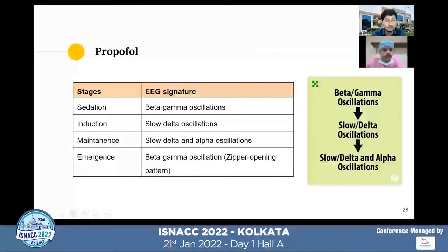With sedation, we can see predominantly beta gamma oscillations. With induction, slow delta oscillations are seen. Maintenance, alpha and delta oscillations. And emergence, we see a zipper opening pattern with predominant beta gamma oscillations.